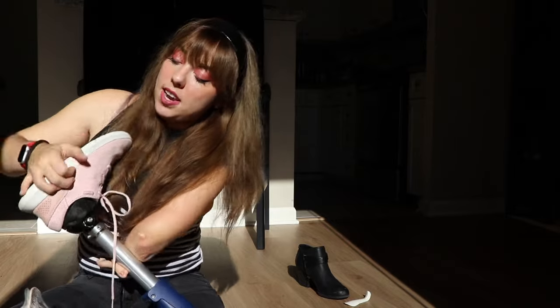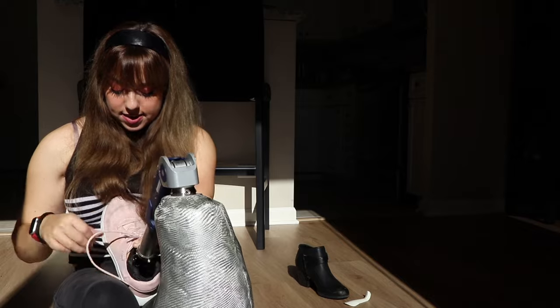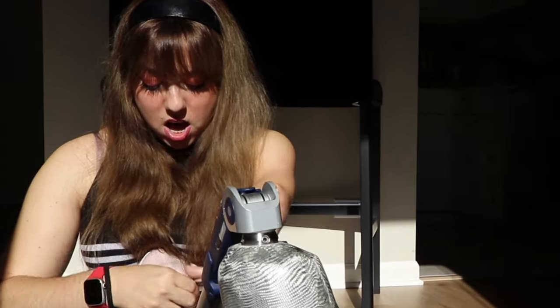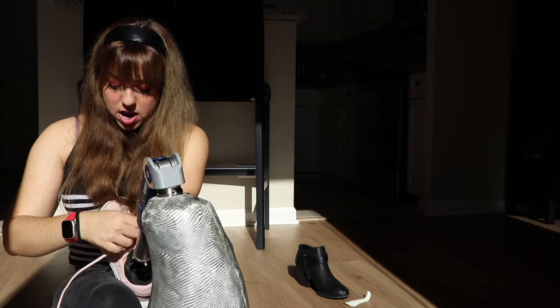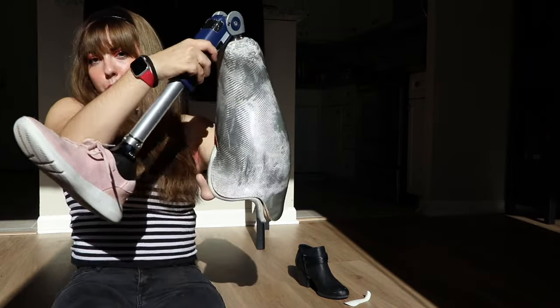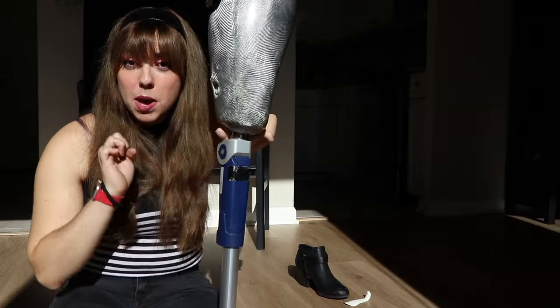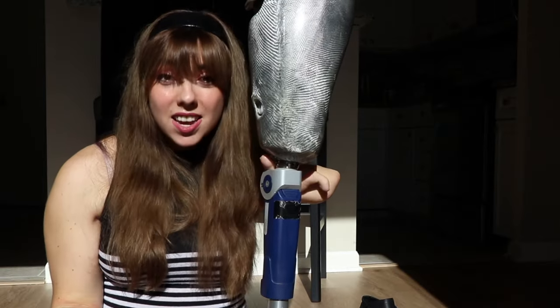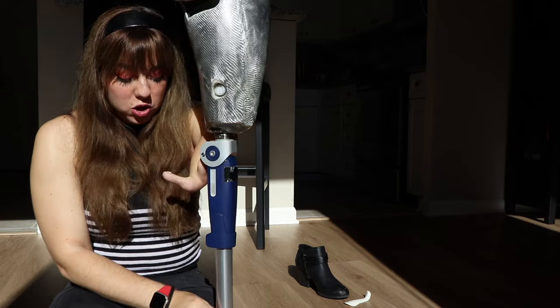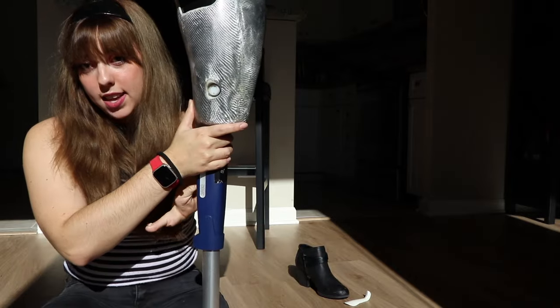It should not need height adjusted. If I was going to re-tie it — which, in this case, I do have to re-tie it a bit — I would simply prop up the prosthetic like this. You're supposed to make a bow first. I clearly don't tie shoes very often! We make a knot, do this whole fun little shindig — how to tie a bow with one full hand. And just like that, we have a pretty little shoe. If for some reason this was not at the proper angle, I would be able to tell within a second of the prosthetic being on. I just hit my head with my prosthetic — which is adjusted using this little button, basically how I'm going to adjust the ankle joint for the high heel.